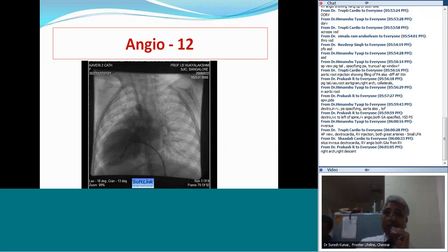So, from the available information, this could be a left lung hemi-anomalous pulmonary venous connection. It would become a TAPVC if a right pulmonary artery injection were to show the same finding. So this is kept just to remind you that if you are shown one pulmonary artery injection, all that we know is that that lung's pulmonary veins are draining into wherever it is shown. Angio 15.